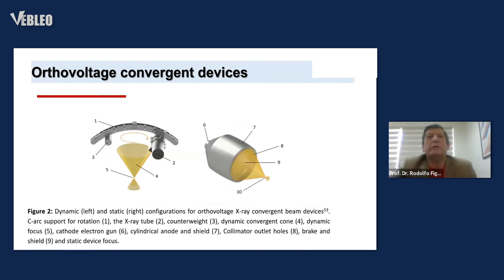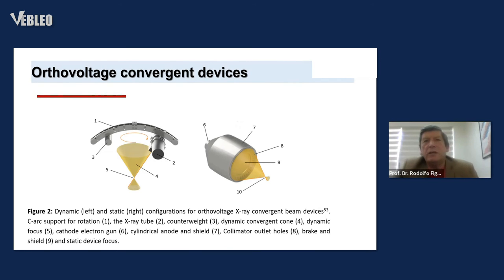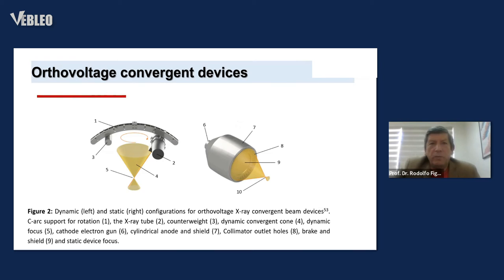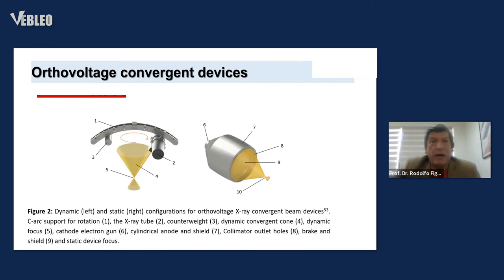Orthovoltage convergent device in development — dynamic left and static right configurations for an orthovoltage X-ray fluorescence beam device. Components include: C-Arc support for rotation, X-ray tube, counterweight, dynamic convergent cone, dynamic focus, cathode electron gun, cylindrical anode and shield, collimator, outlet hole, brake, shield, and static device focus.